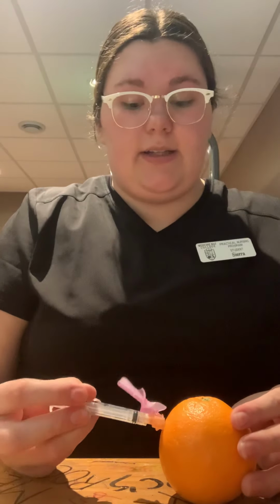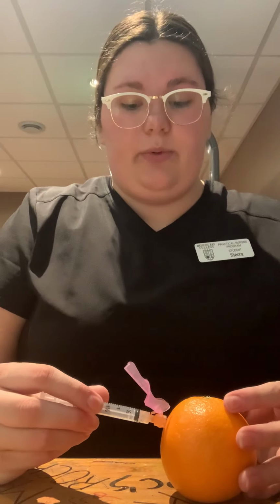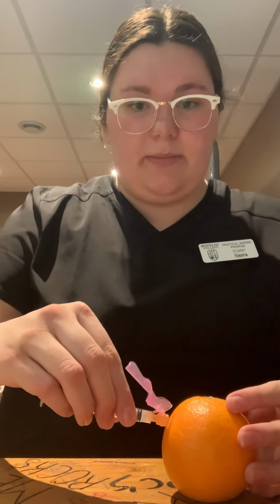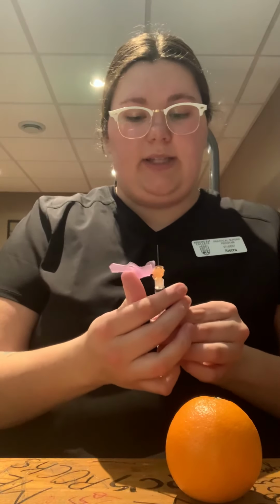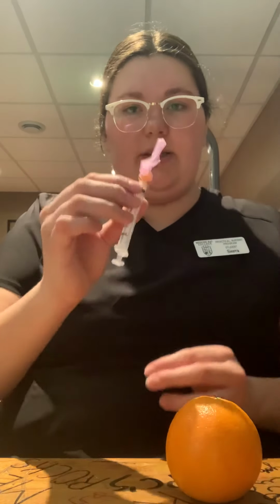Also, because this is an intramuscular injection, we're going to wait at least 10 seconds before removing the needle. So that was about 10 seconds. So we'll remove the needle at the same angle that we did. Put our safety back on our needle. And then we're going to dispose of this into the sharps bin.